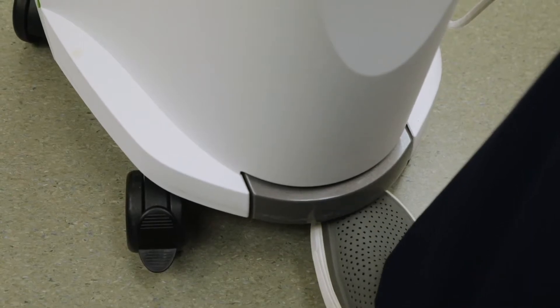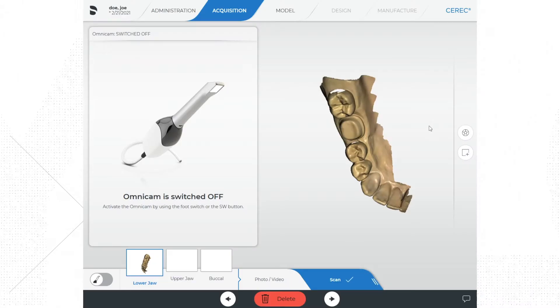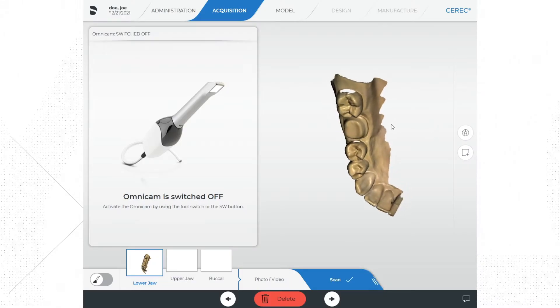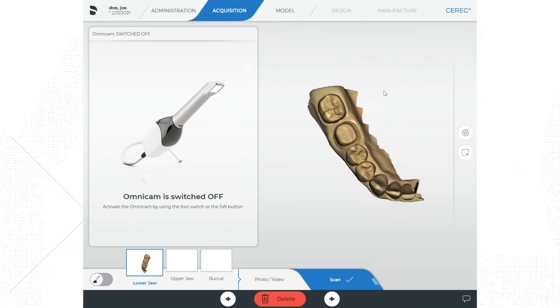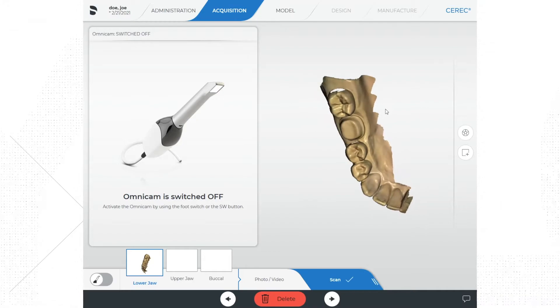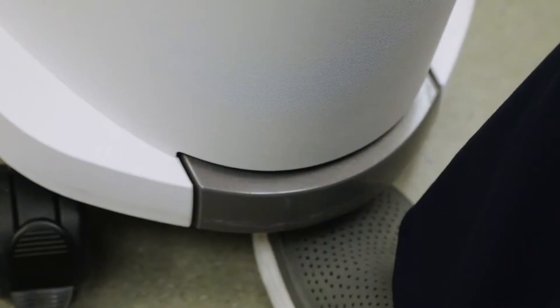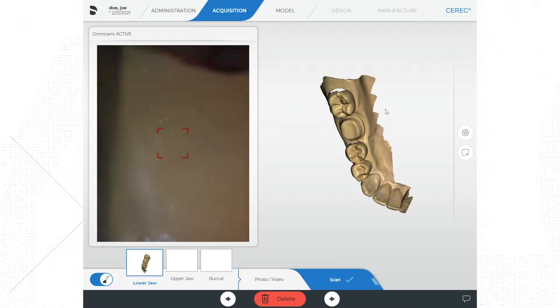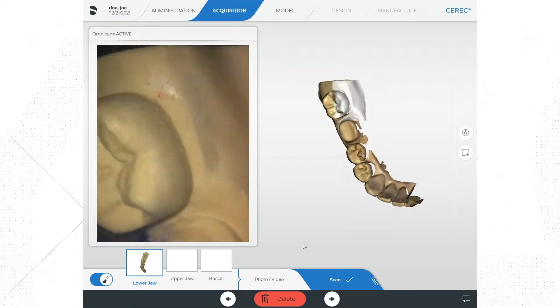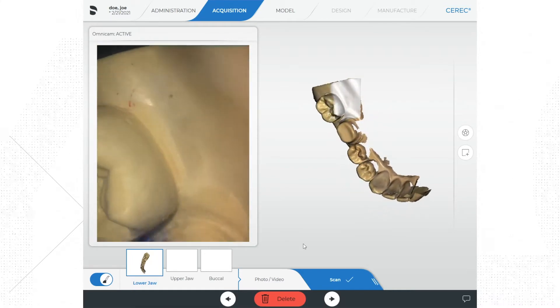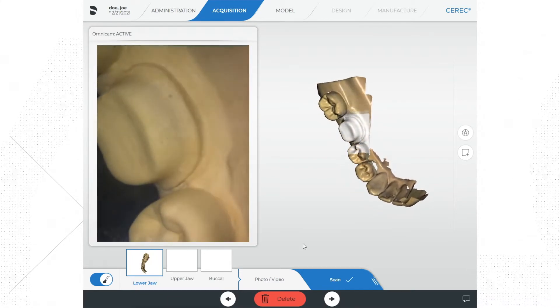On the front and bottom of the Sirona machine is a gray foot pedal. Scanning can be started and paused by upward pressure on the foot pedal for one click. When the camera is paused, the digital model on the right side of the screen can be rotated and evaluated. If more scanning is required, simply reactivate the foot pedal to fill in the needed voids.